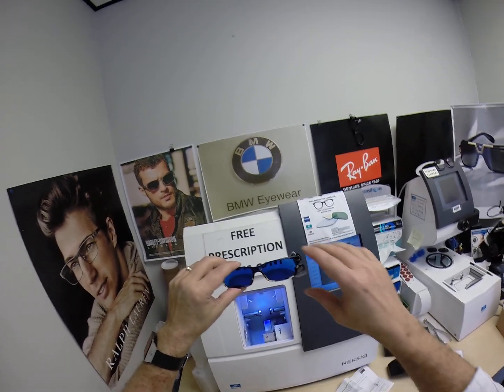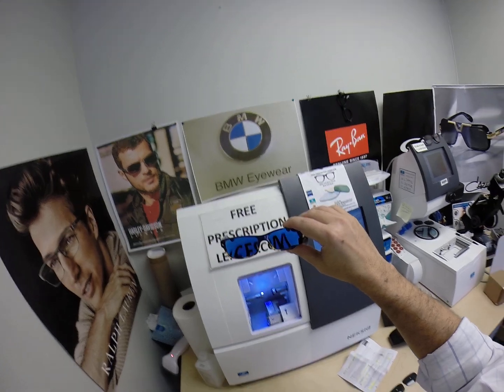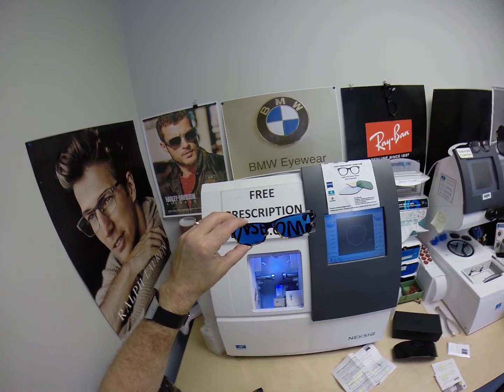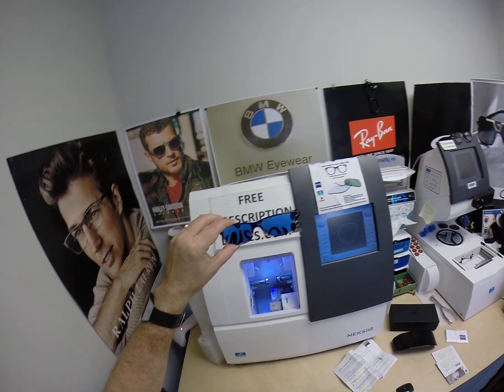Now, having said that, Zeiss does have the Photofusion Extra Gray lens. It's designed for extra active people who spend extra amounts of time outside, and they will get 30 to 50% dark behind a windshield. They also, the extra active, have 50 to 70% blue light protection. These have 30 to 50% built into them.